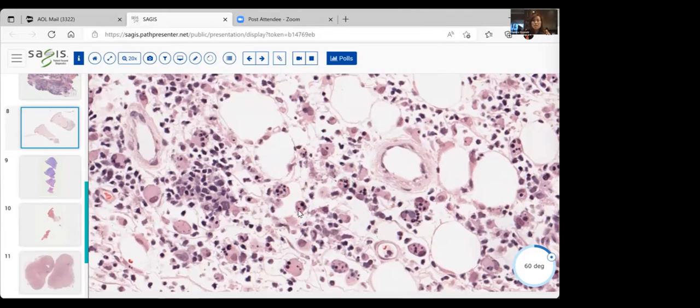These are beanbag cells, and the condition is called cytophagic histiocytic panniculitis. Now, this is really, really scary when you see it, because although it can represent a post-inflammatory condition, this is a spectrum. This could also be representative of a more multi-systemic fatal process where you have hemorrhagic diathesis and hemophagocytic syndrome. So this could be okay, or it could be really bad.